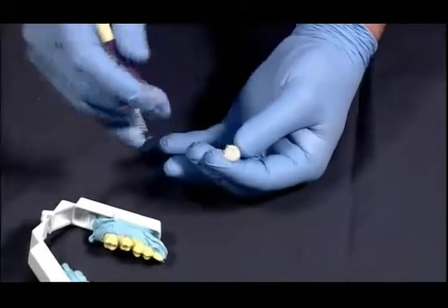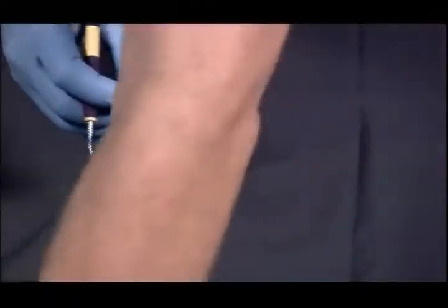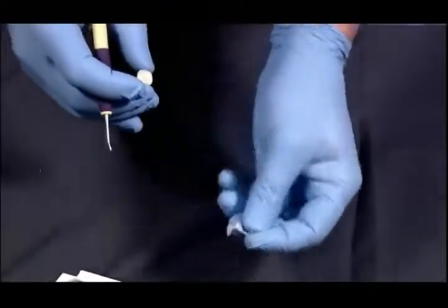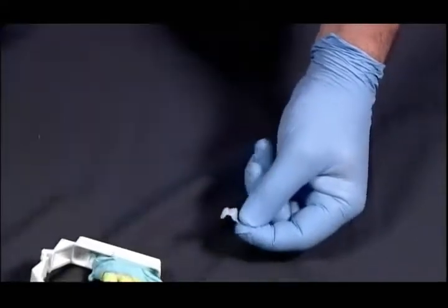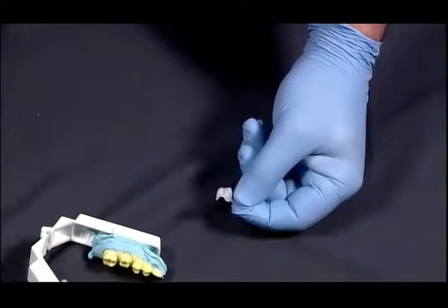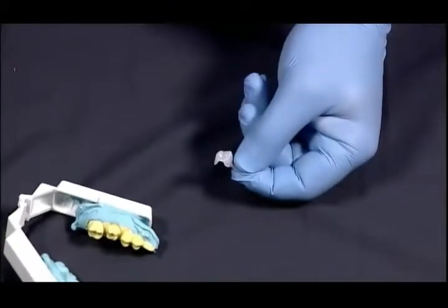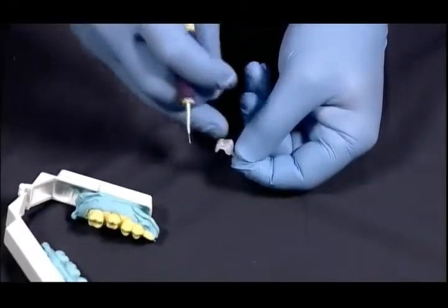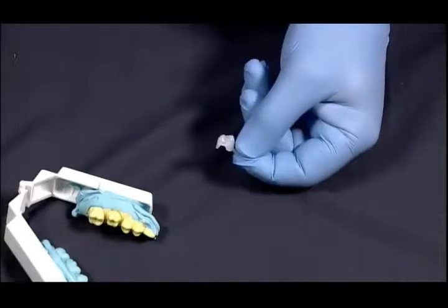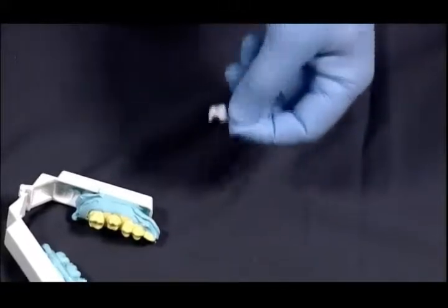Okay, one of the parts of the process here that I really should tell you about is in the fabrication of this crown shell. You will see that there's a window that's cut out of it. That window allows us to make variations of the interproximal contact. So we could have a wide contact, we could have a narrow contact. So in the three sizes that are in this particular crown shell form, it gives us the ability to fit virtually every tooth that you'll ever run into for that particular tooth size.